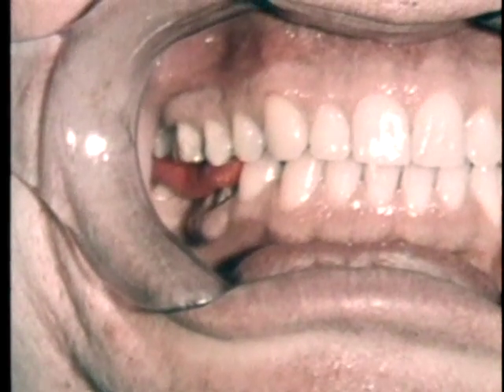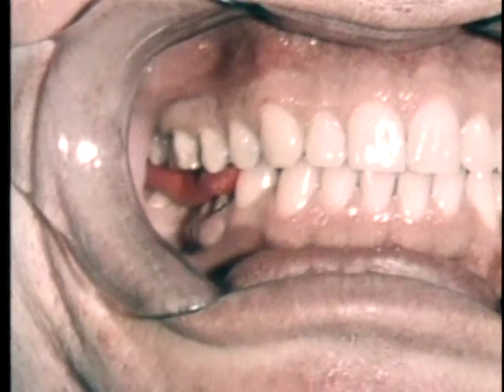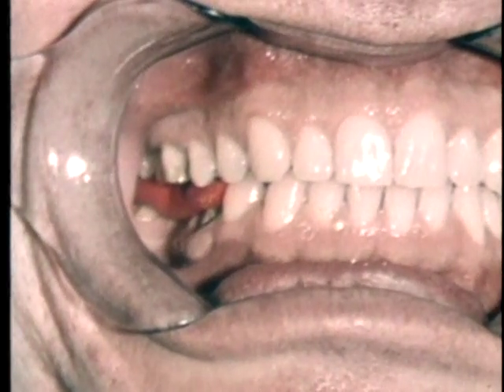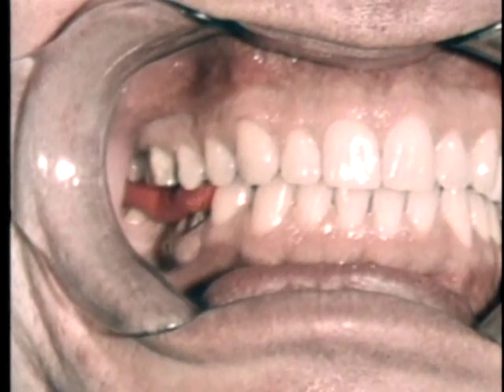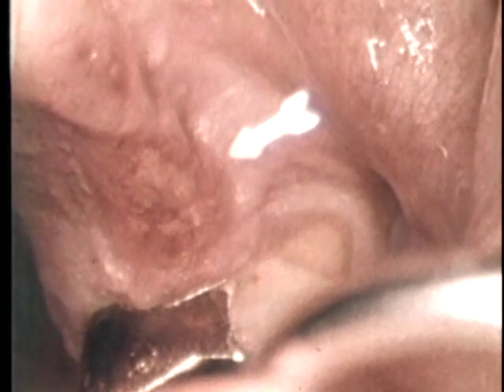The stage of resin polymerization here is critical. If the material is well into the doughy stage during closure, distortion will occur. The resin should be inserted as soon as it possesses sufficient body to be handled. The wafer is removed at initial set. Prolonged retention can cause tissue damage from the heat of exothermia, common to these resins.